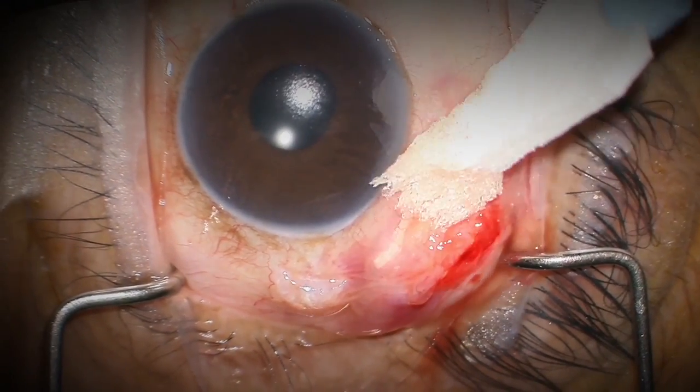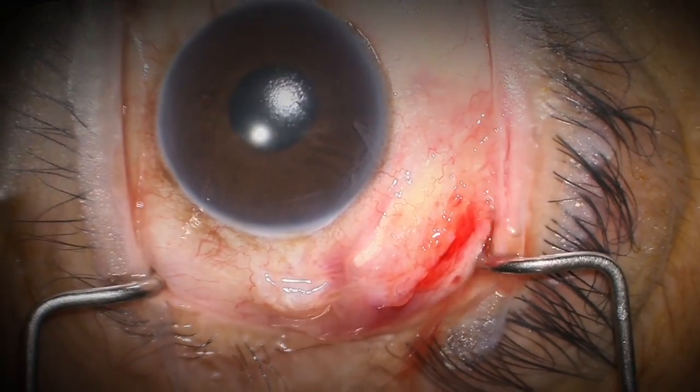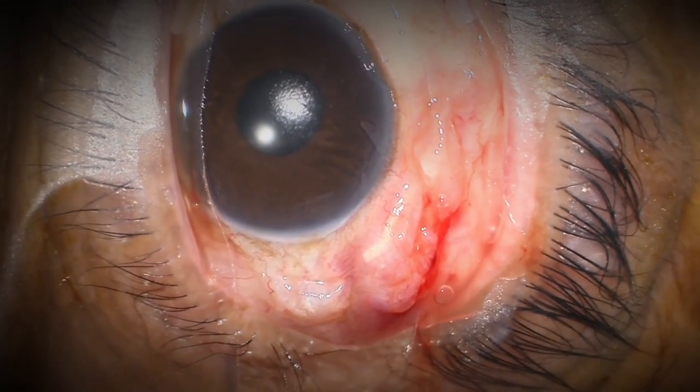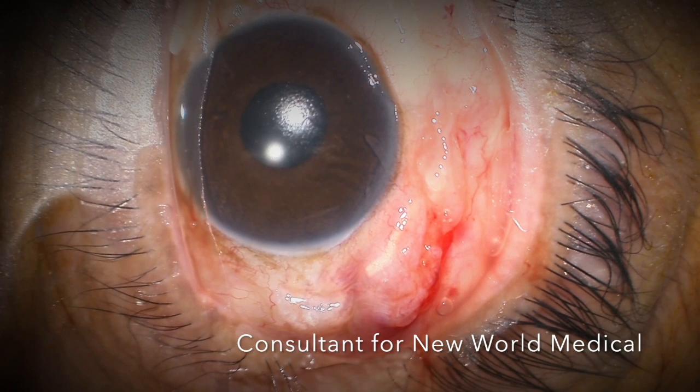The advantages to this technique are that the patient will require less steroid to heal. The eye is going to be less red, as you can see here as we're finishing, resulting in more rapid visual recovery and patient comfort.